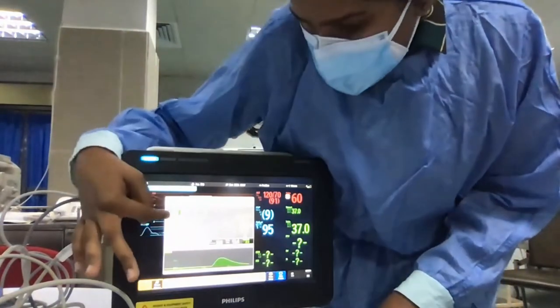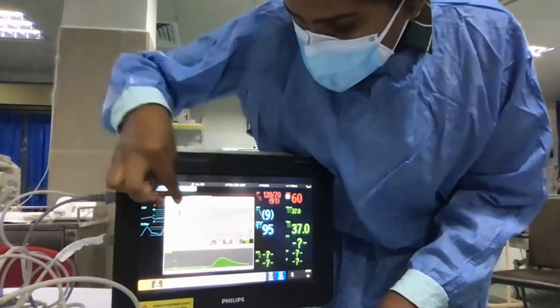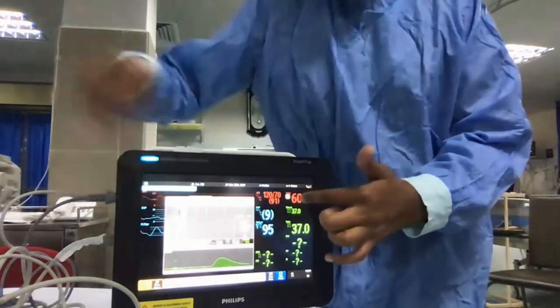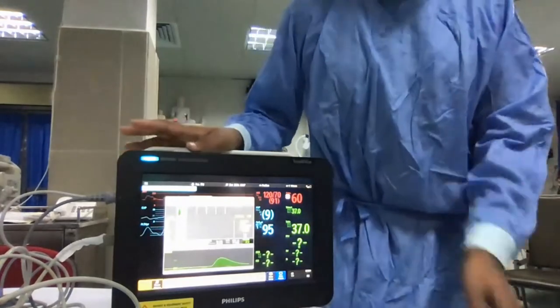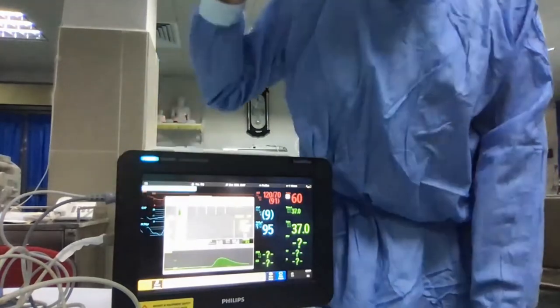So cardiac output and everything is indicated here. Anyway, my injection was not successful. In the demonstration mode, they don't take it, and everything will be a cross sign. That means we have to repeat another one. If not, they will be indicated in the green color.